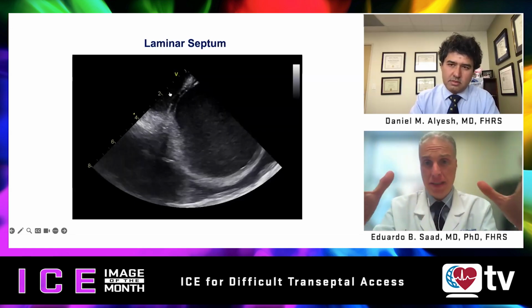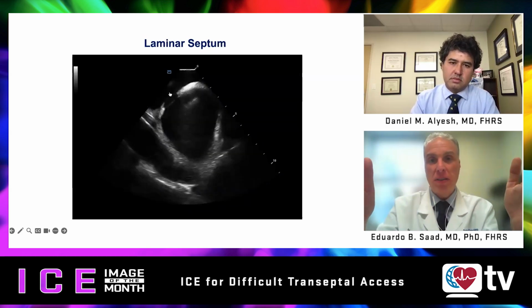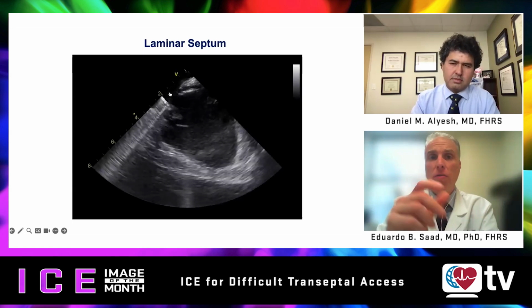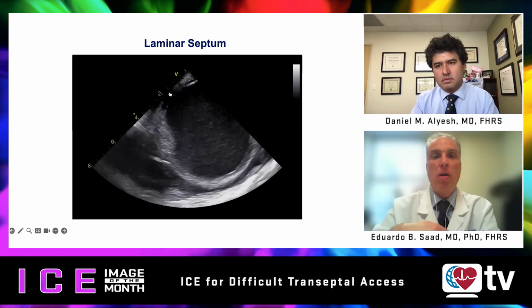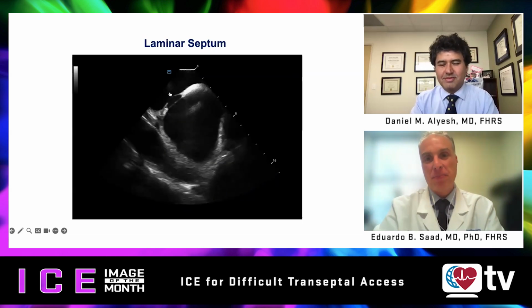It's a different appearance. And maybe when you look at it first, you say, oh, it's going to be a very hard day in the lab to go across. But it's usually not. Those layers, at least in my experience, most of the time are not thicker or even harder to go across. You just have to realize that you're going to have to go across twice.